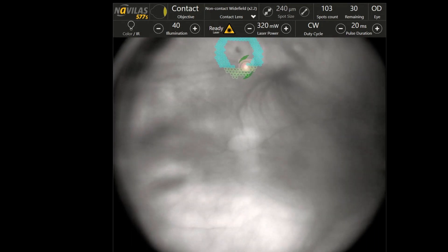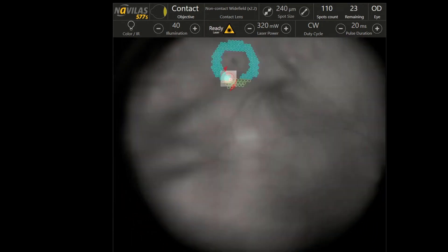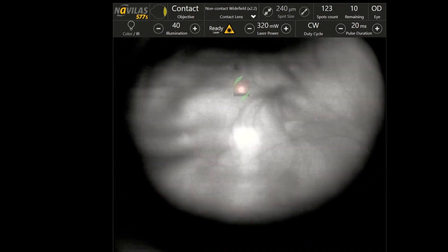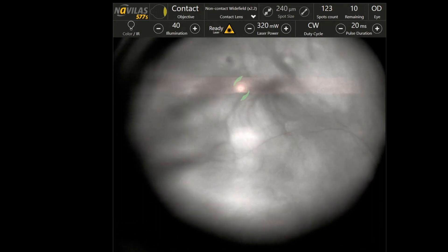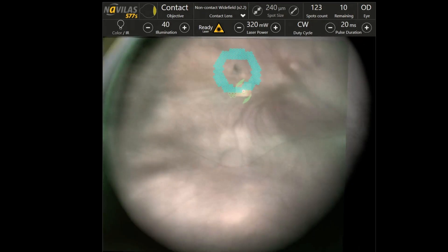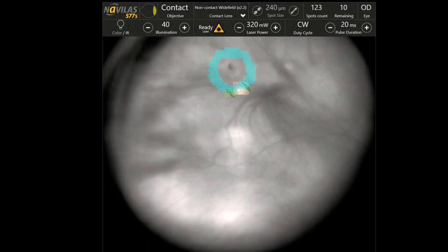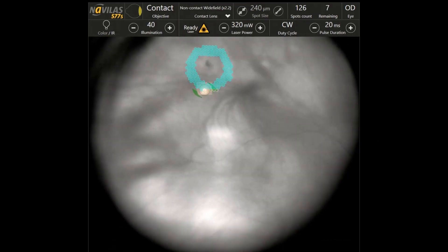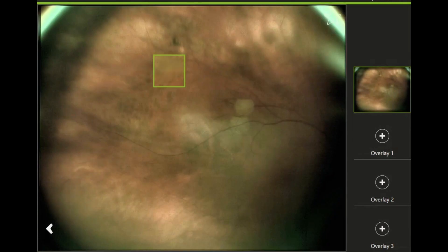As the treatment is done under infrared light, at the end of the procedure a color image was acquired to prove the sufficiency of treatment. The overlaid animation demonstrates retina whitening in the place of laser application.